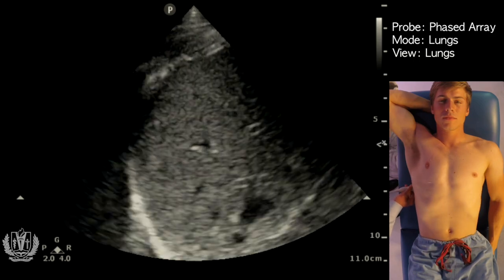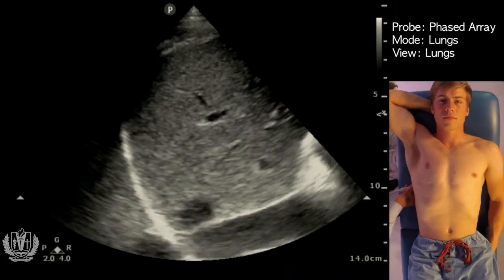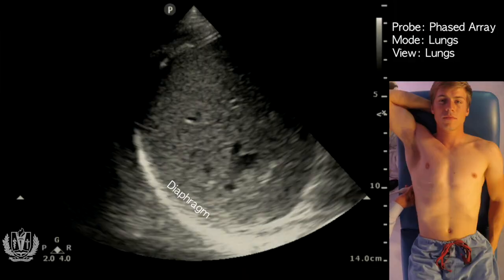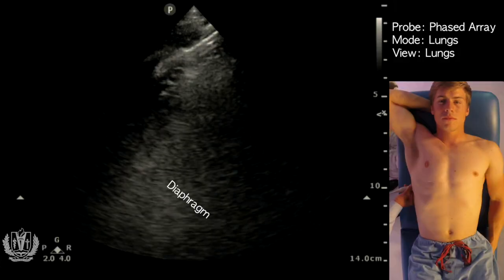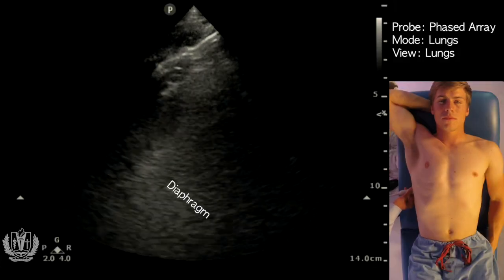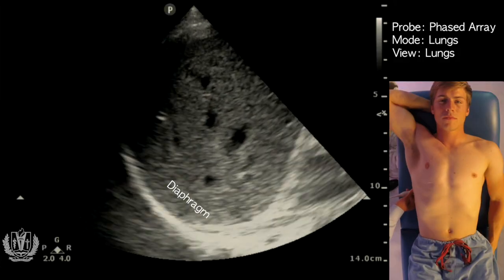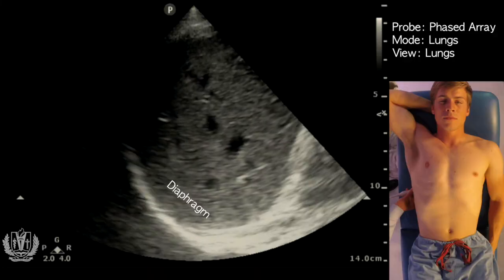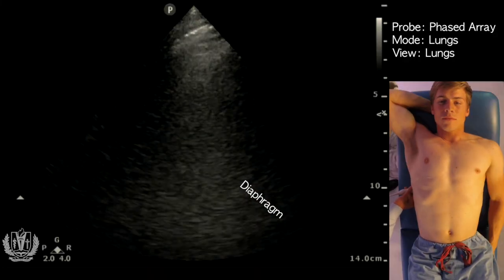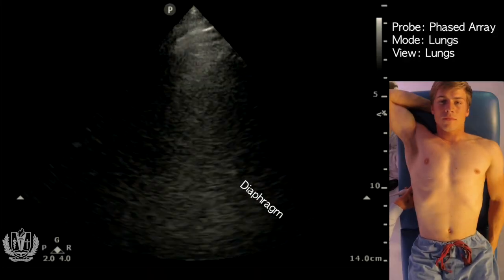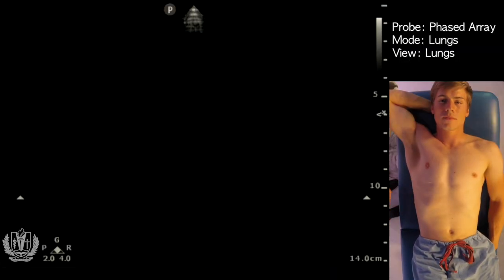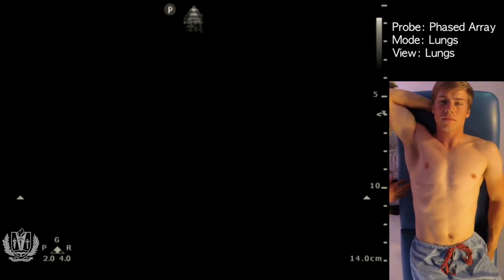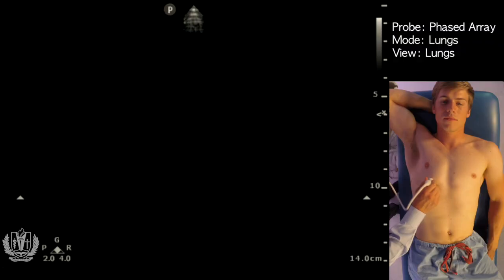If you increase depth further, you can actually see more of the diaphragm. If you're assessing a patient for diaphragmatic paralysis, this is also a good view to use. Have the patient breathe in deep and you can see it moving normally. You then assess the lung in the posterior areas to complete all six areas.